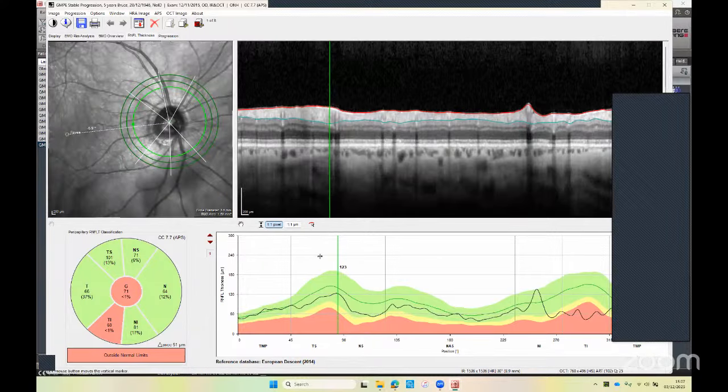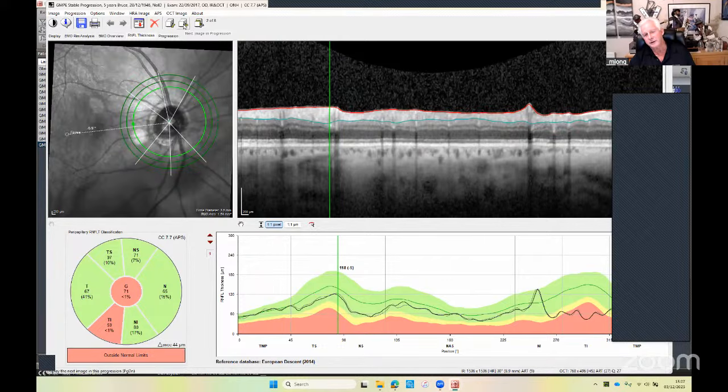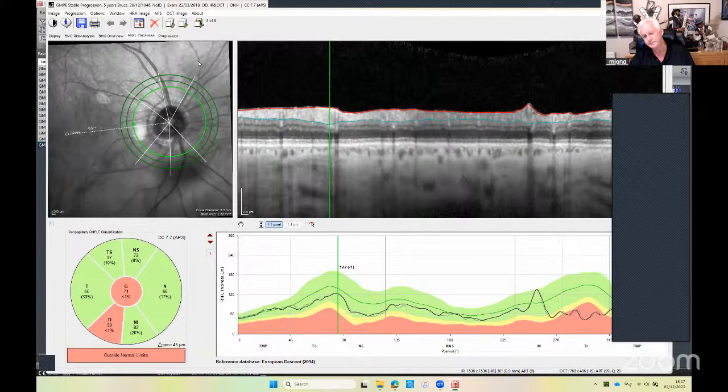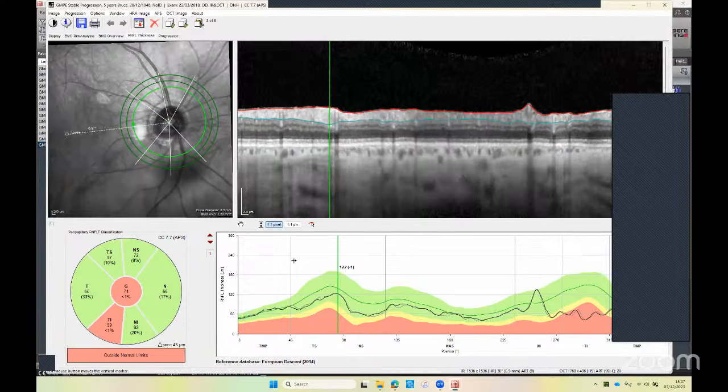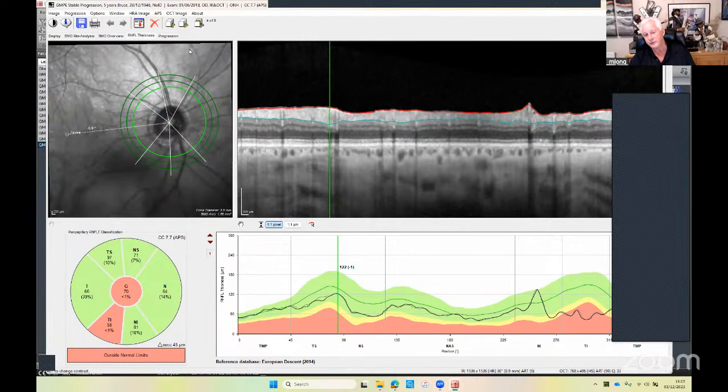Martin, can you just explain that within the bracket, what was given is like -1, 0, -5? In the bracket is 5 from the previous exam. So we've gone down 5. Is it from the previous examination or from the baseline? From the baseline, yeah, from the baseline. So we can track what's happened just by looking on the profile, if you want to look at it that way, just to show you.